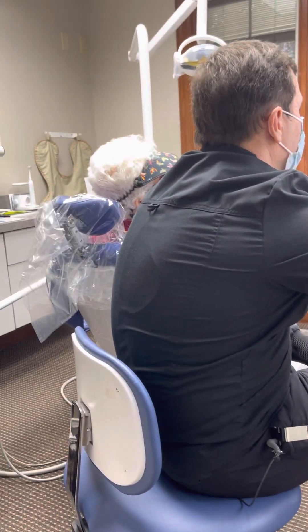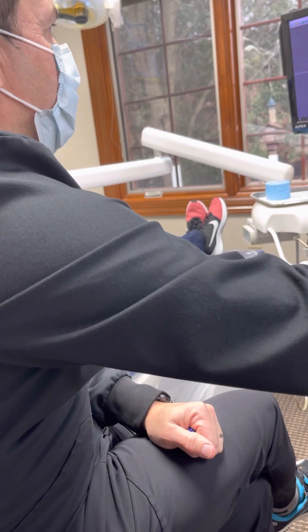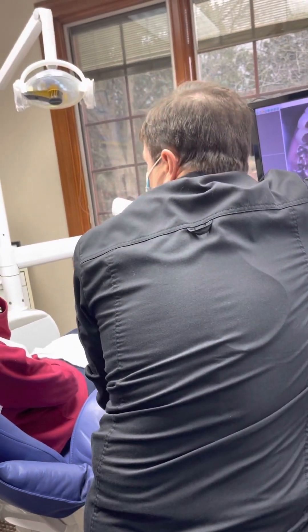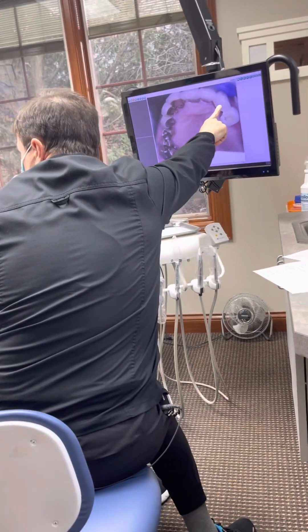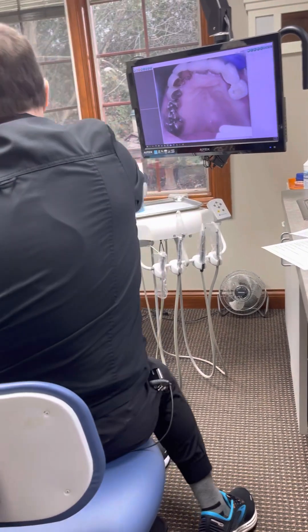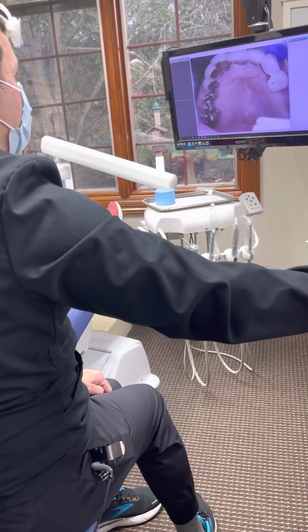Looking at that angle — which is the tooth we came in for — to the right, these two right here... it's her left side. This one right here, yeah — that's the one she came in for, that's the one you're touching right now. And then that's the one that's missing, the fake one. That's the last tooth up there in the very back. These are all on the right side, and the right side is fine — yeah, the right side has all this metal.